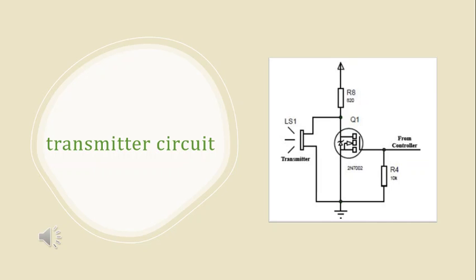The function of this stage is to convert the electrical signal into ultrasound waves. The transmitter was connected to the output frequency amplification stage, which is a MOSFET transistor, to secure the highest voltage of the transmitted signal without distortion. Resistor 8 is connected to the drain of the transistor in order to determine the current draw, while resistor 4 was connected to secure the zero-point bias.